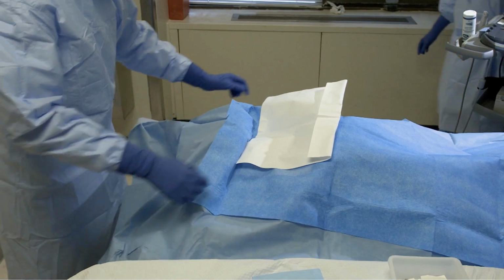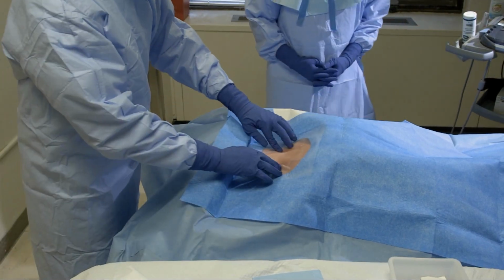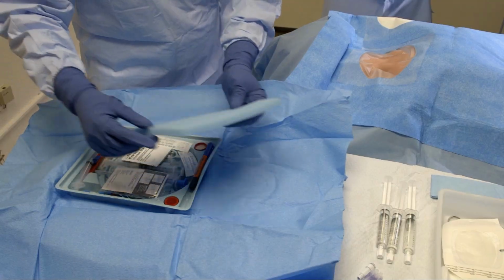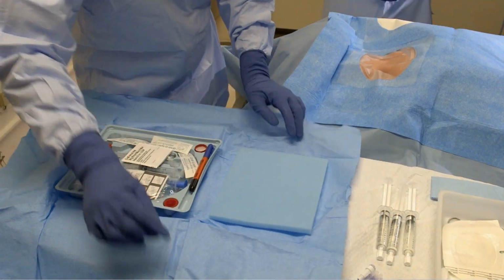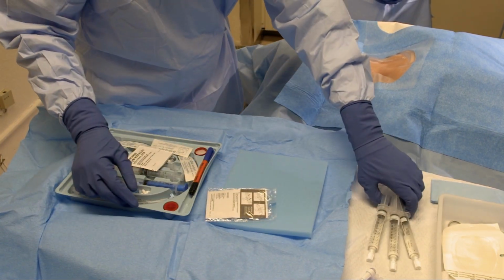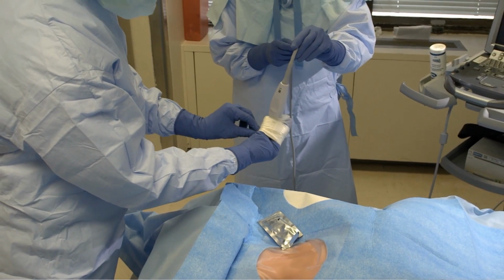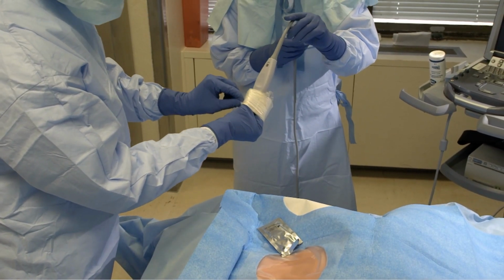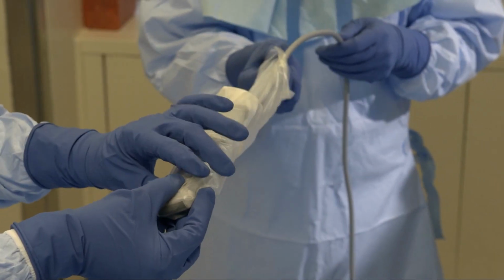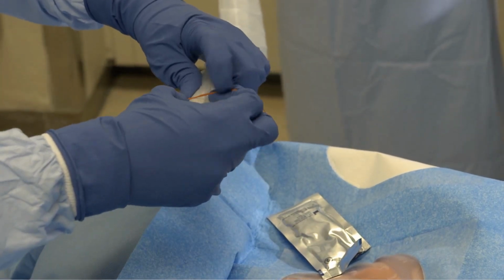Place a sterile drape over the patient, making sure to leave the procedure site exposed. As you prepare supplies for the central line procedure, be mindful of all sharps and their placement on the sterile field. When preparing for the use of ultrasound, allow the second healthcare worker to assist. The third healthcare worker, in addition to monitoring the patient, is also available to assist should the need arise.